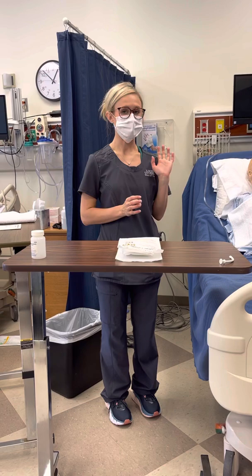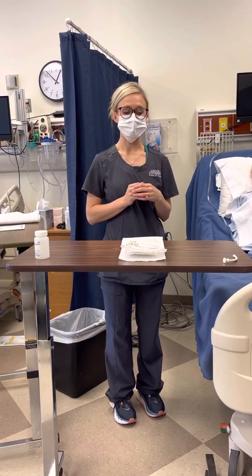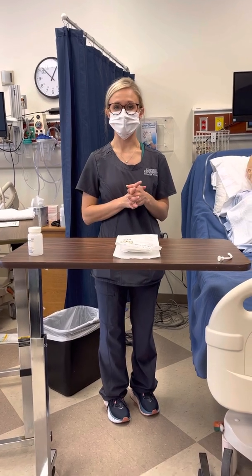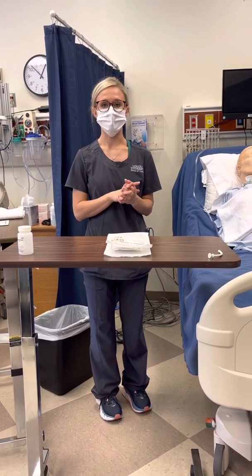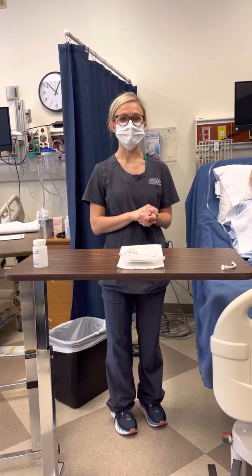I'd make sure that my patient is in semi-Fowler position, and that there is an extra trach and obturator at the bedside just in case anything went wrong. I'd also make sure that my patient has some type of communication with me, such as raising his left hand, if anything were to go wrong.